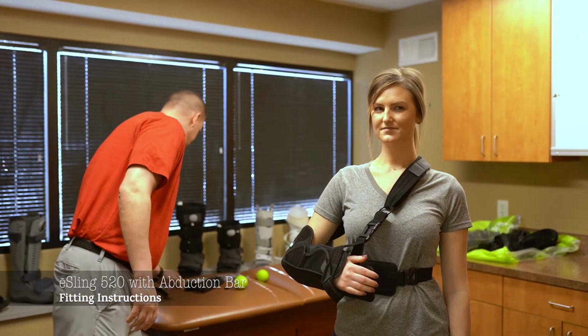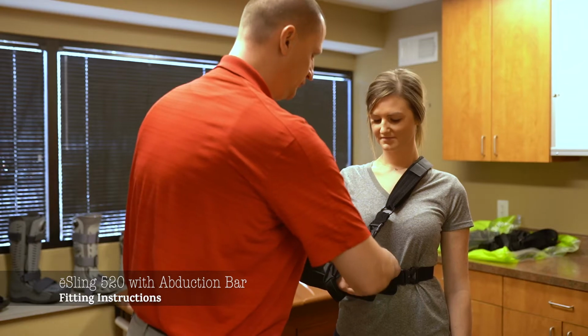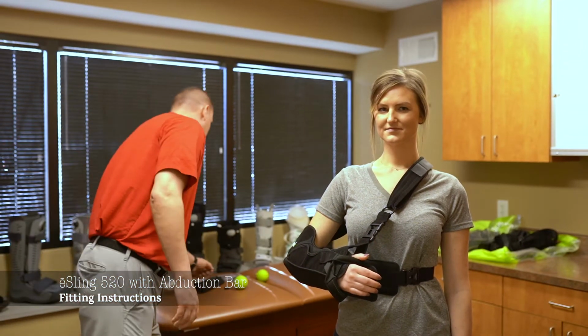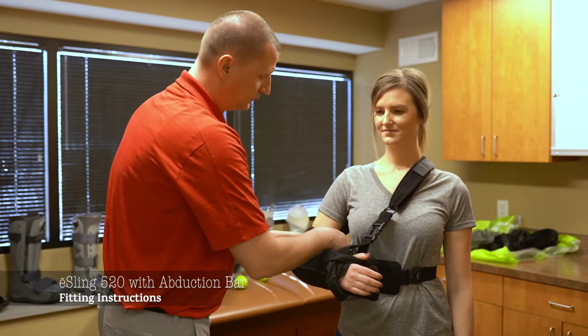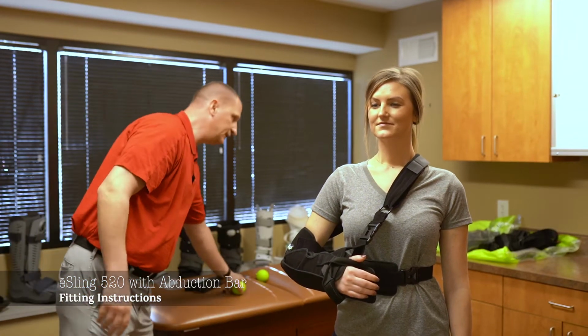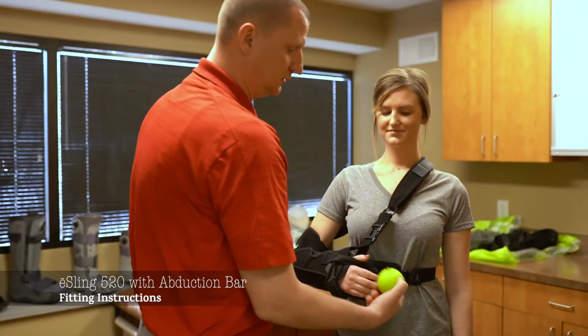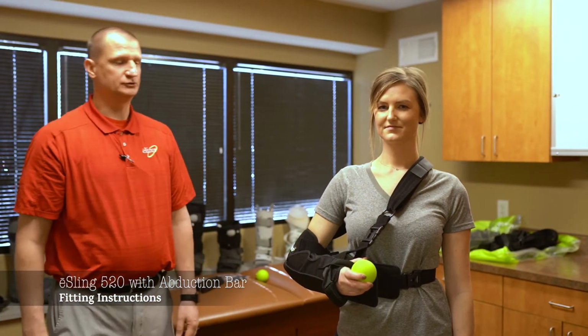We can also add our accessory features, such as the thumb strap, okay? And we also can add our bicep strap to keep the elbow back. Once this is completed, we can add our little ball onto the rail so the patient can get to it for any part of her home exercise program.